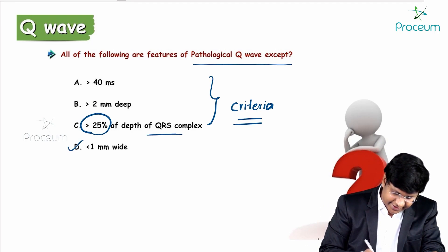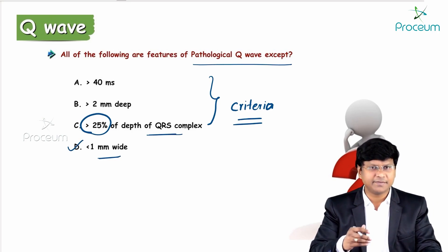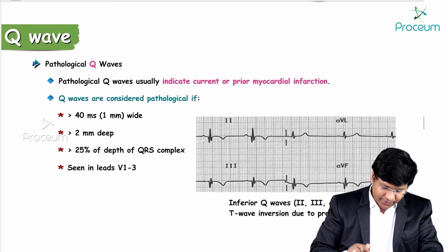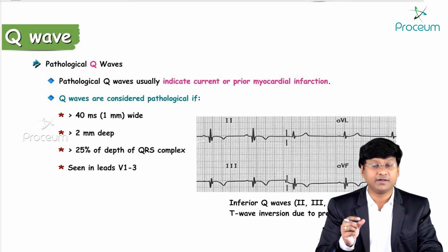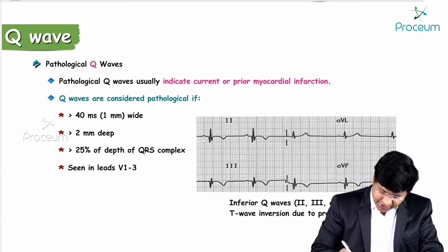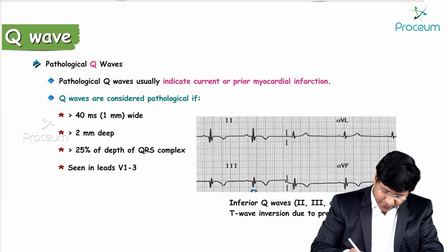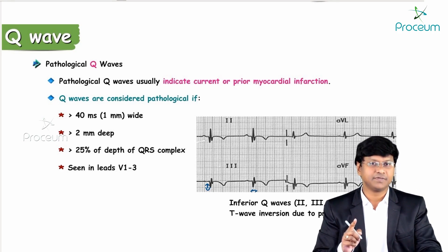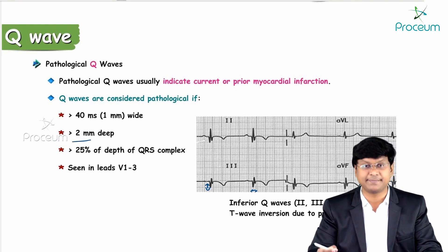Here is an ECG showing a pathological Q wave. The duration is more than one small box — more than 40 milliseconds wide. The depth is more than 2 mm, which is also considered a pathological Q wave.